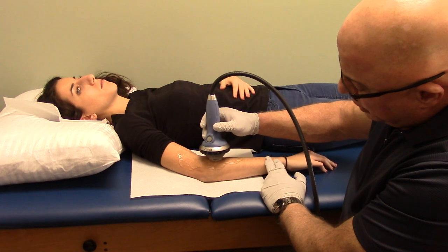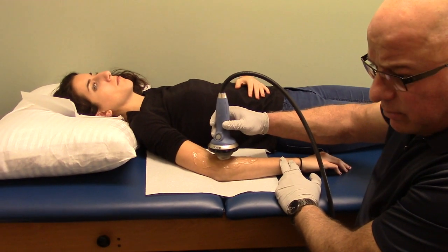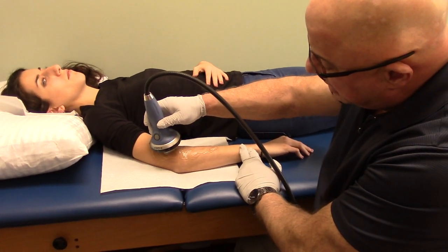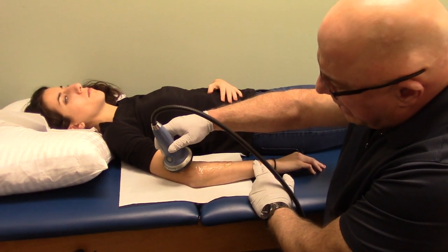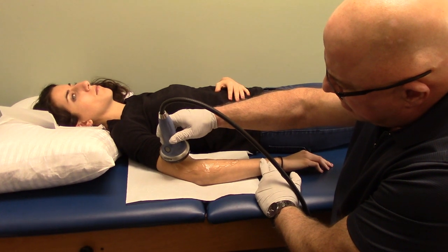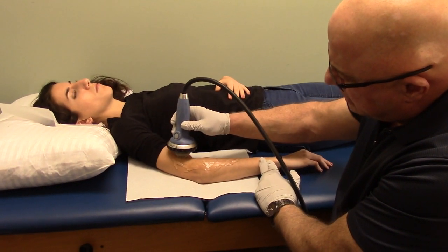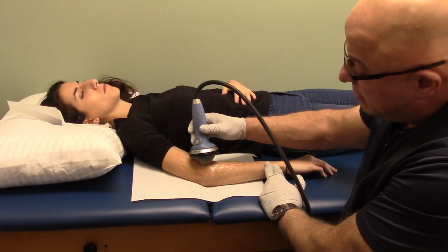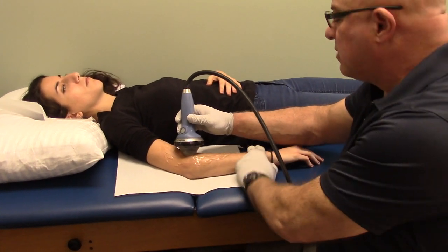If by the second or third month the patient tells me they're about 90-95% better, basically they're done. But sometimes they say they plateaued at about 80-85% improvement. In that case, I might decide to do one, two, or three more additional treatments to get rid of whatever residuals are remaining.